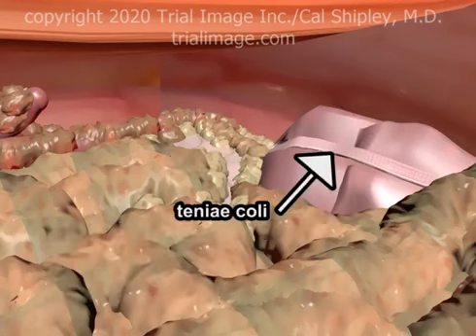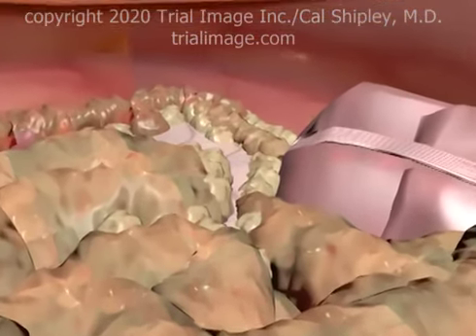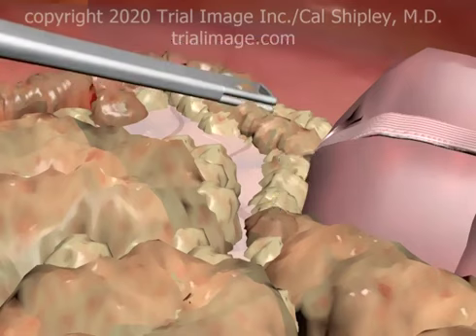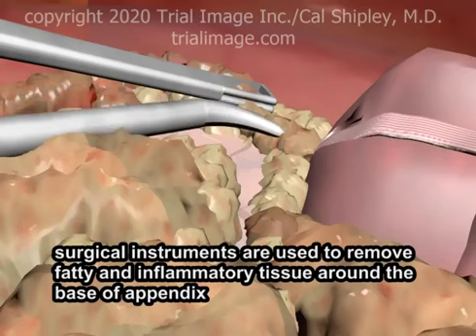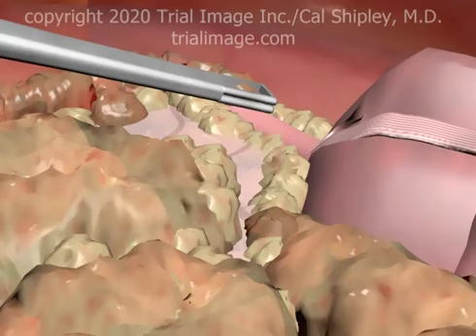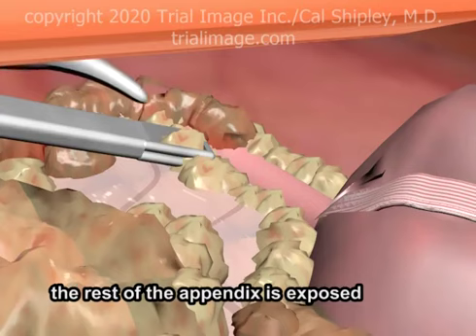Once the cecum has been identified, the taenia coli may be used to determine the location of the base of the appendix. Surgical instruments are used to remove fatty and inflammatory tissue around the base of the appendix. Once the base of the appendix has been exposed, the surgeon systematically exposes the rest of the organ to its tip.